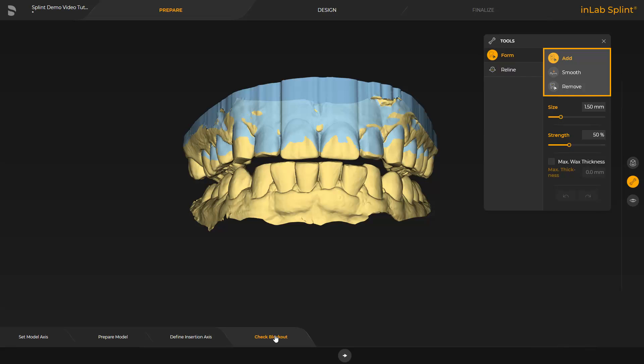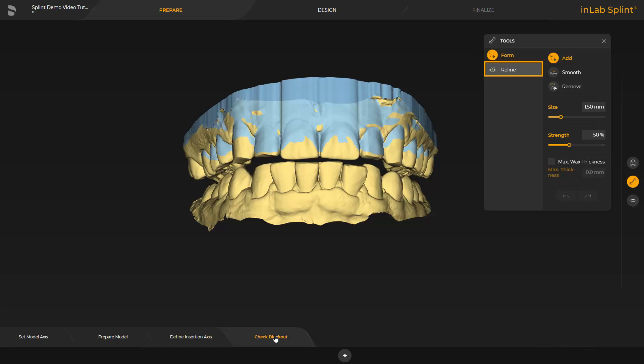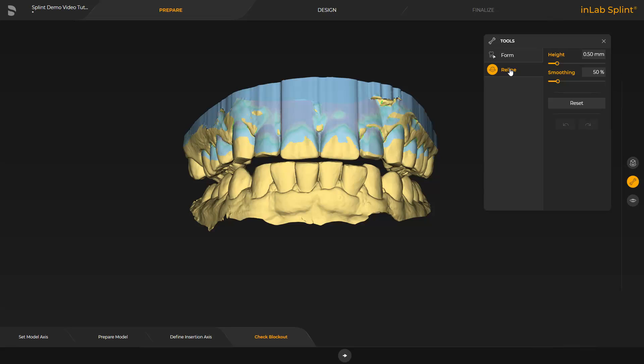The wax can be modified with the form tool. You can add, remove, and smooth wax. The max wax thickness parameter can be adjusted to determine the amount of wax to be applied. We switch to the reline tool. This tool makes it possible to cover a marked area with block out material. To get to the next phase, we tap the little arrow to the right at the bottom of the screen.